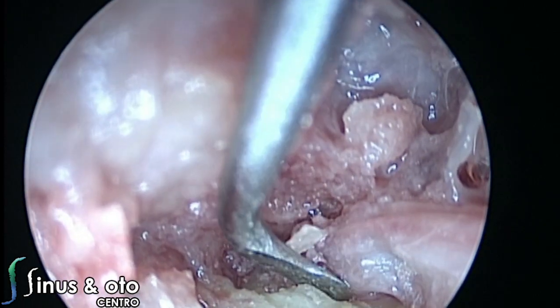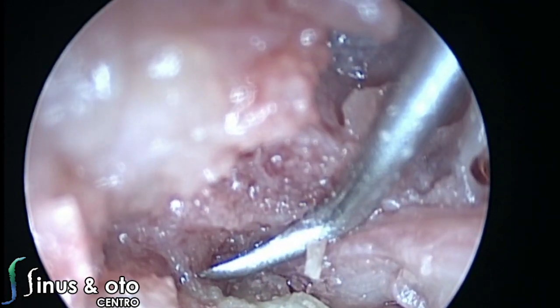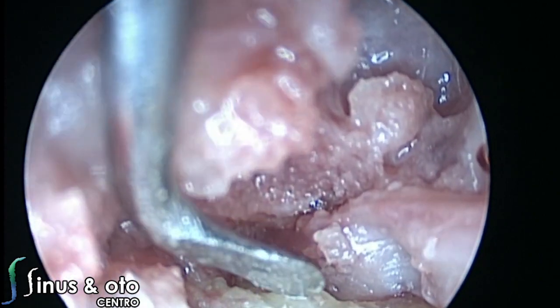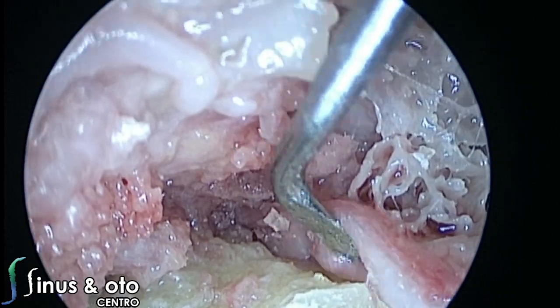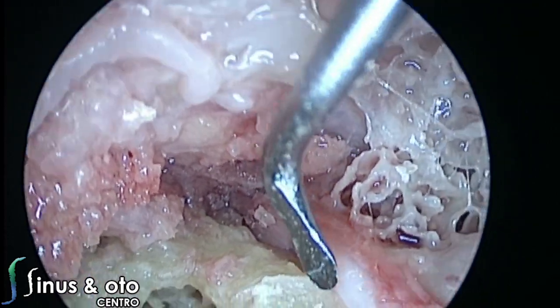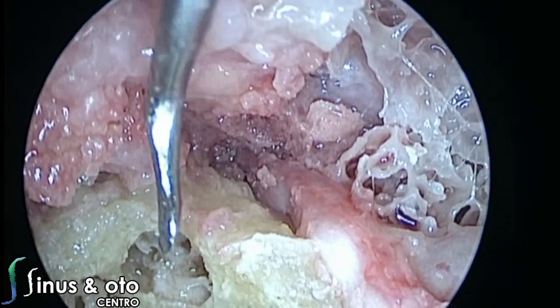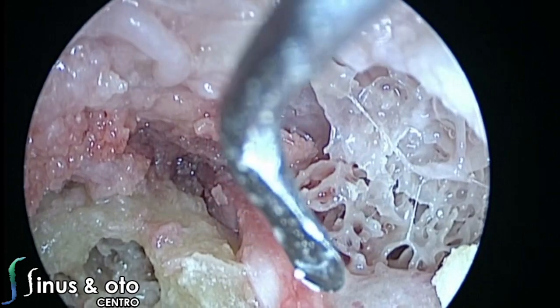So we have the facial nerve, greater petrosal superficial nerve, and the geniculate ganglion over there. Facial nerve going down, and the greater petrosal superficial nerve going to your left, following the pathway of the muscle and following the pathway of the eustachian tube. You can also elevate the facial nerve from its canal, the tympanic segment, just to understand the anatomy, just to understand its position in the inner ear.